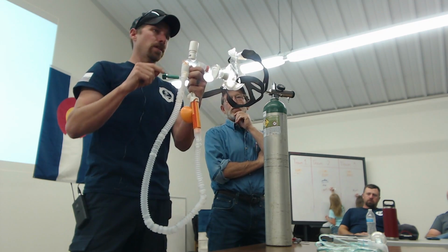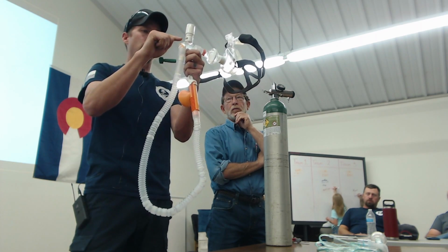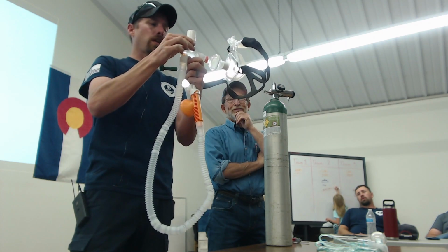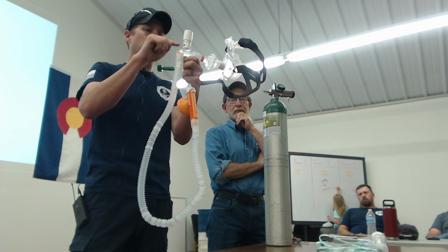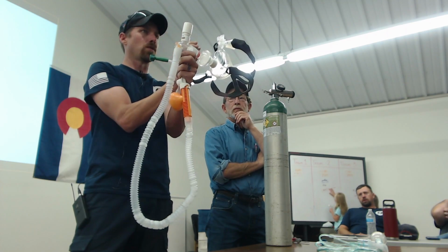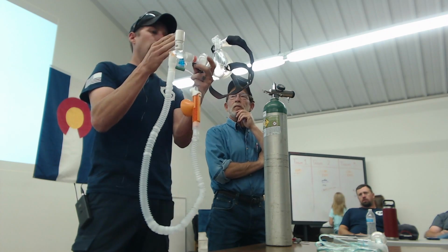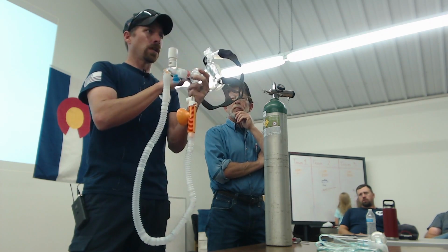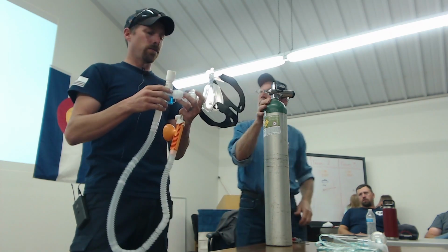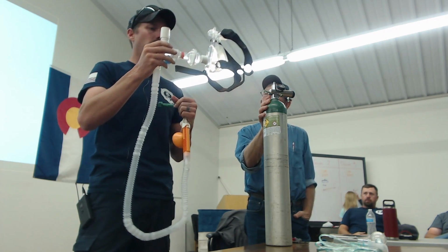The other versions of this, the newer versions, the HEPA filter is actually right underneath this PEEP valve. And that is actually what you're going to see on the ambulance. This is an older training one. But the one on the ambulance will have the HEPA filter right underneath the PEEP valve, which makes this whole operation a little bit smaller. That's a new advantage. So either way, you're going to get filtered inhalation and exhalation. So when you're doing this operation and creating those aerosols, especially with any kind of COVID patient, there's a safety factor there for us.